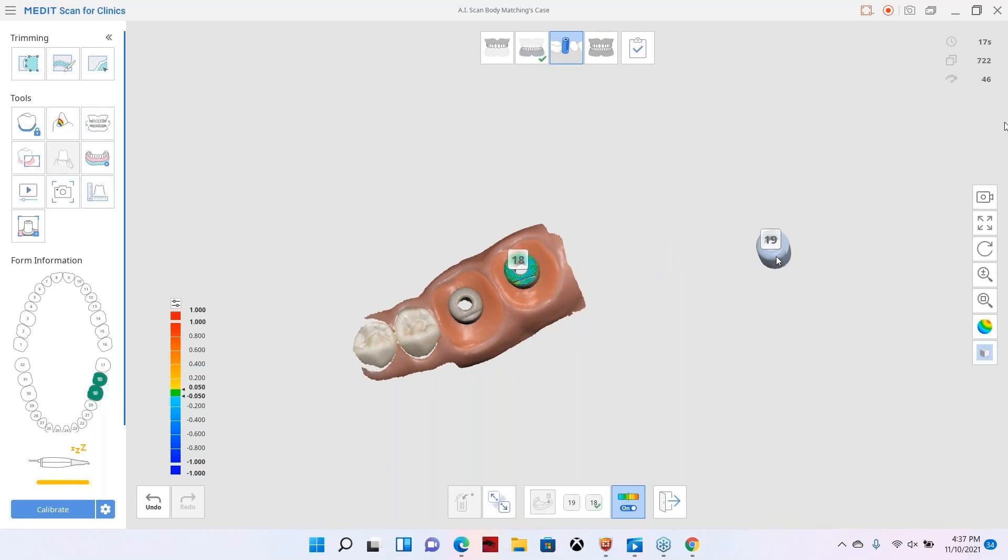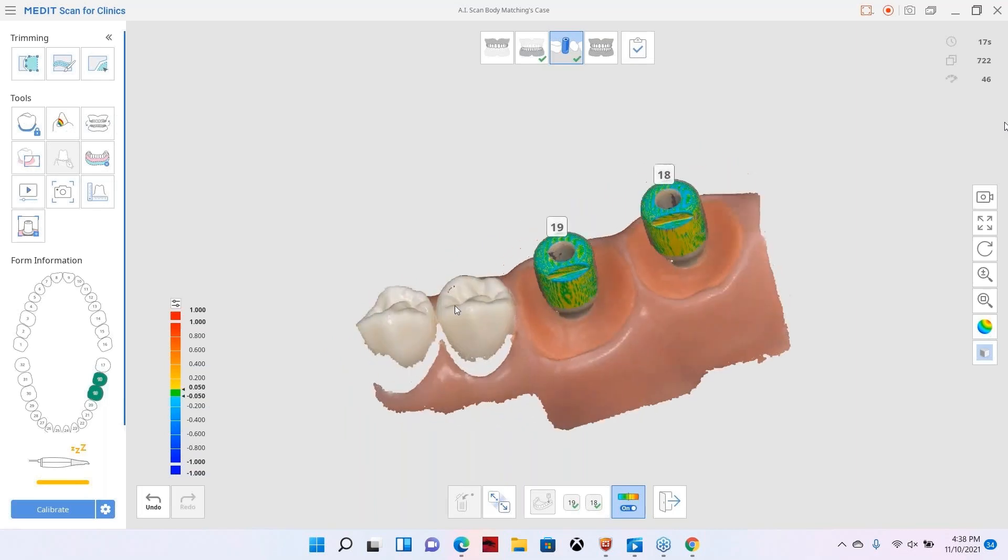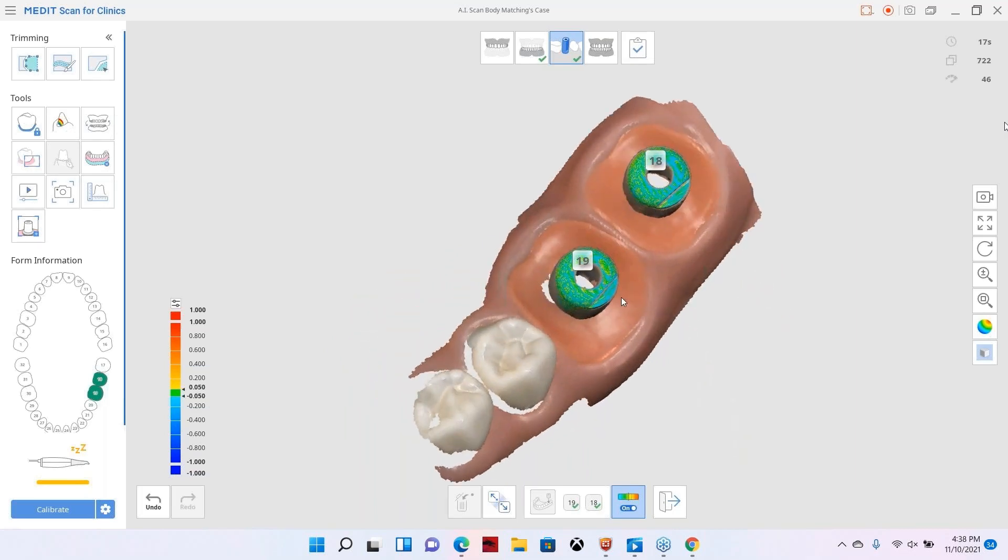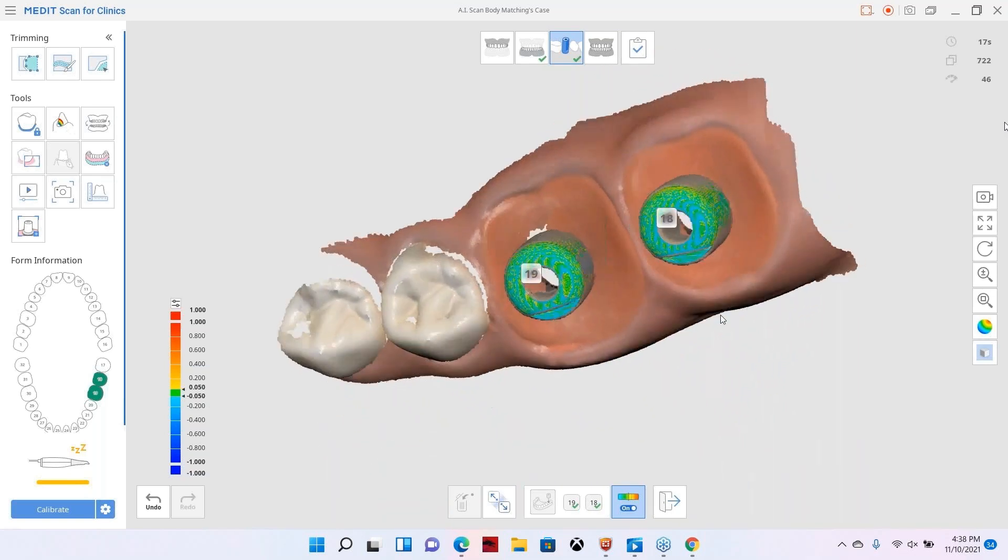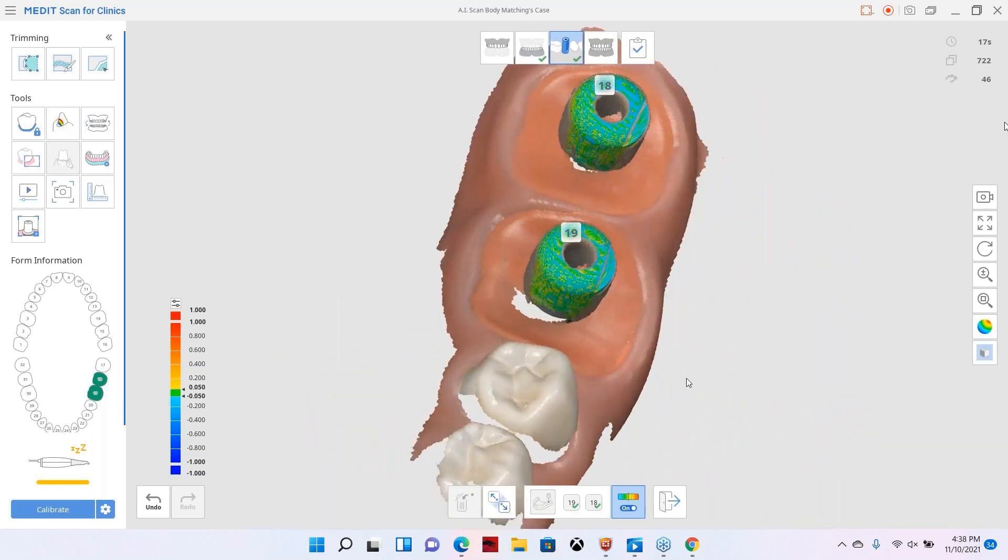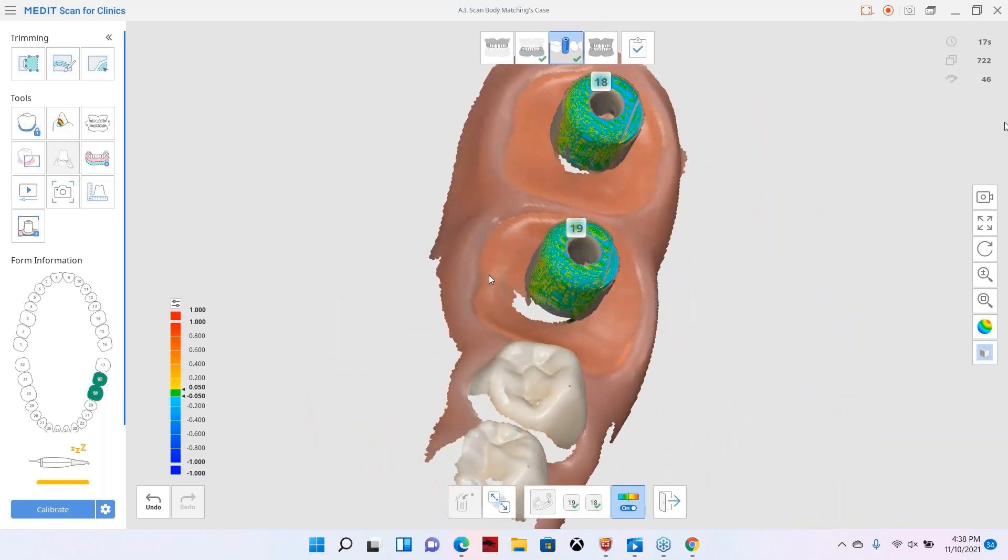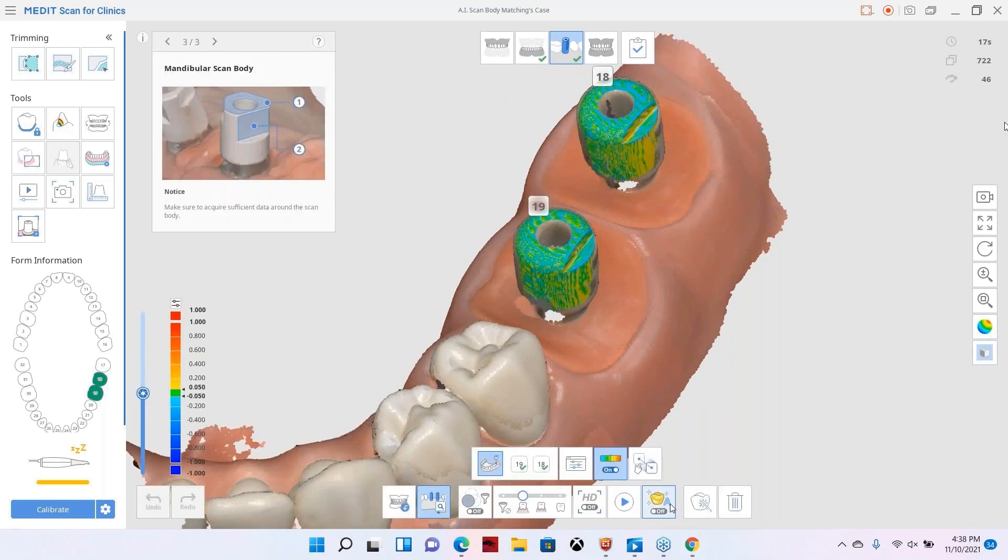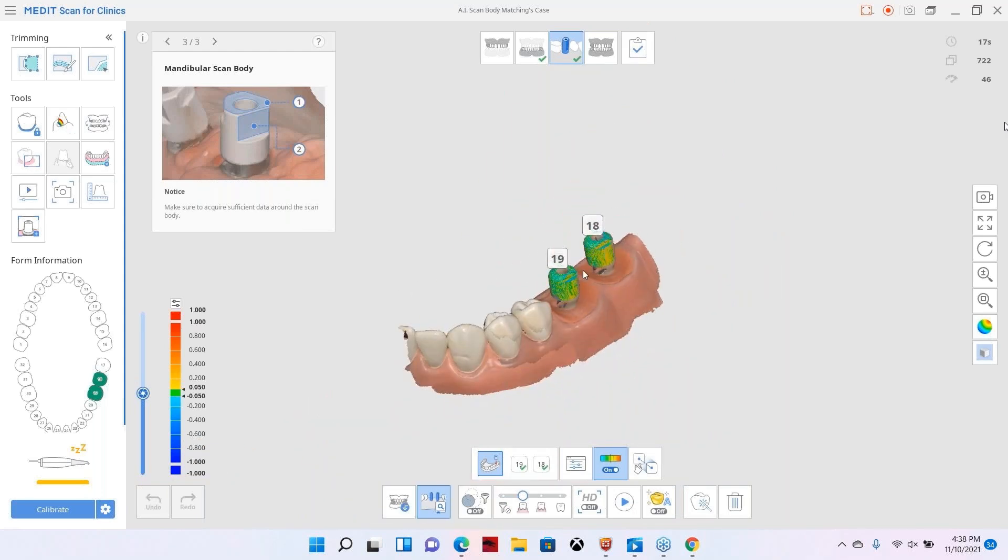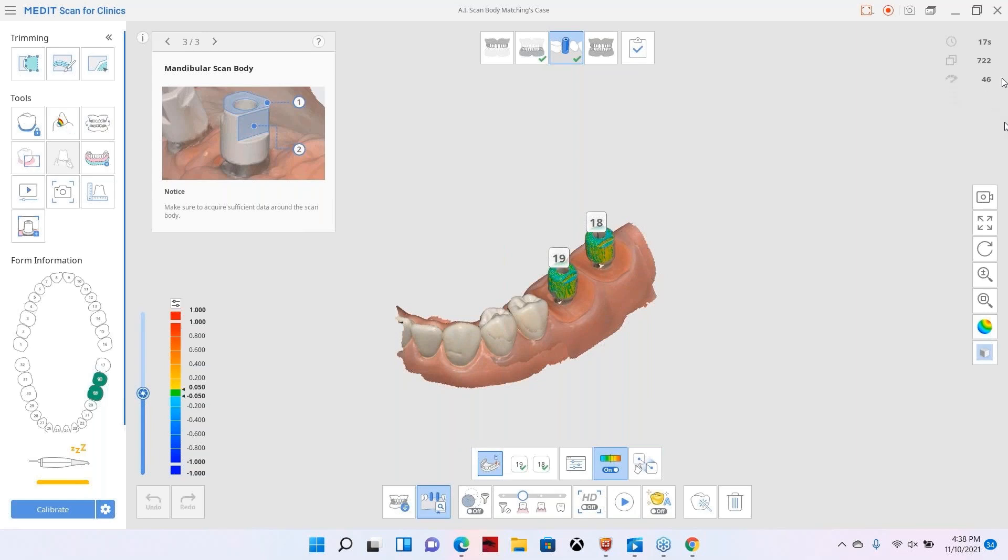You'll see that those scan bodies that we've selected are now on the screen with our intraoral scan. We've got number 18 here that I'm going to align with a single point alignment and you'll see that merge. Let's go ahead and pull number 19 over here and let's do a two point alignment on the scan body here and we'll click on the scan body from the intraoral scan. You can see immediately how both of those scans merge. You can tell by the coloration there, the closeness, the accuracy of that merging. And now with that update again, how much easier it is. So when you have those scan bodies in the mouth, you can go ahead and just start scanning and then assign the scan bodies later.